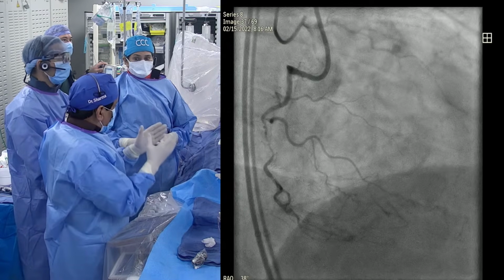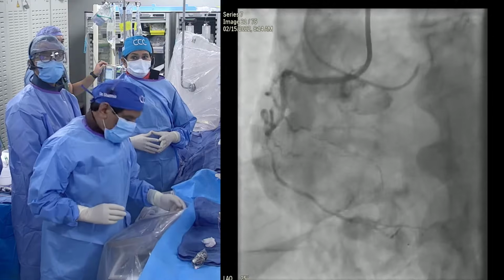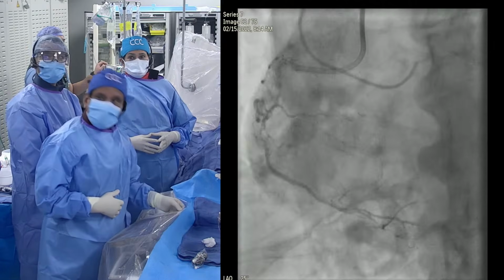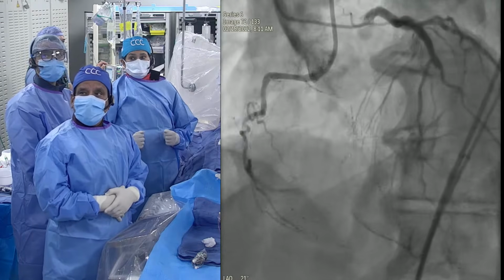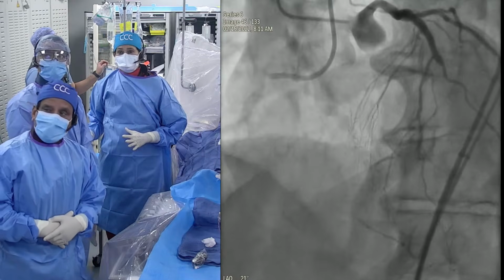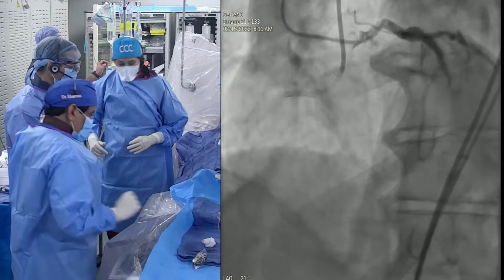But once you already have ischemia, there's no need for viability, and you saw how big the right coronary artery is. It fills by so many collaterals. Look at that, mega right coronary artery. Probably in this case, I would say LAD supplies 40% of the myocardium, and 45 or 50% comes from the RCA, and circumflex about 10 to 15%. Look at the big right coronary. Completely agree with you.